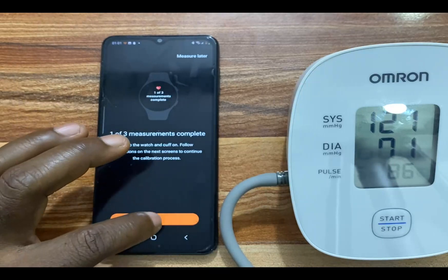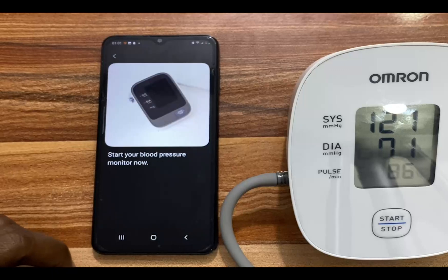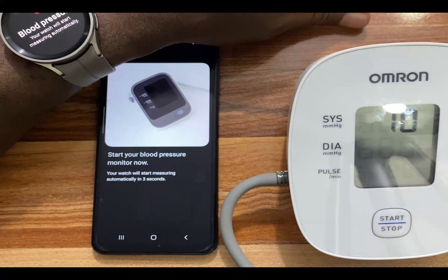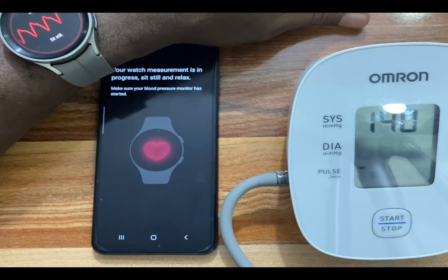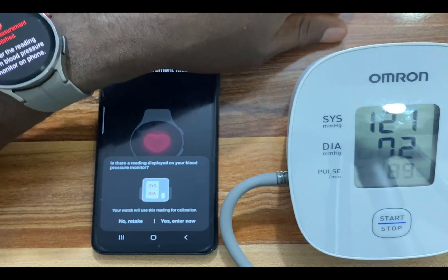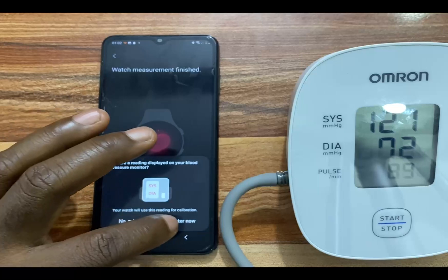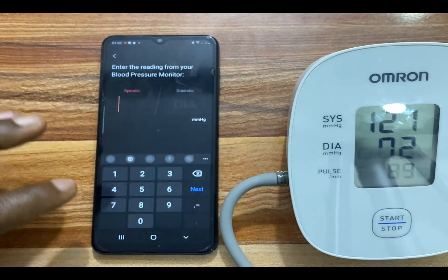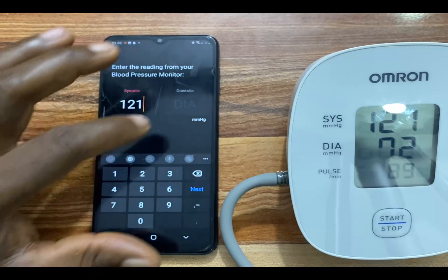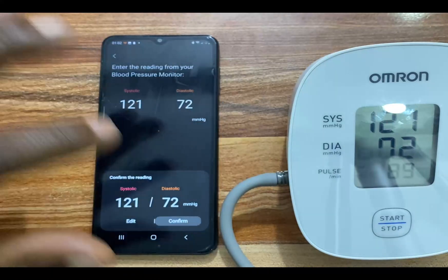Tap on Next, and tap on Next again here. Start the blood pressure monitor again. We have the second reading — this one is 121 again, diastolic 72, and 89 beats per minute heart rate. I am going to enter 121, diastolic is 72, tap on Done, and confirm this.